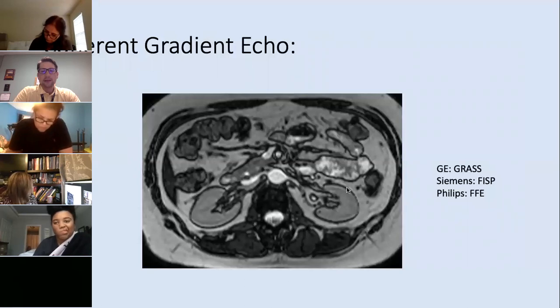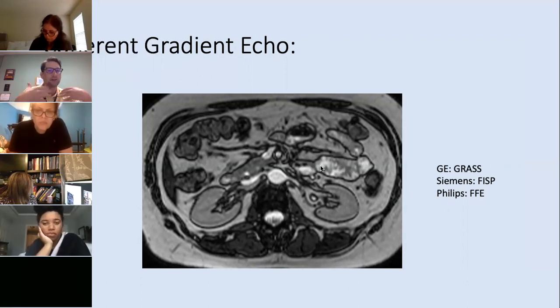So it's still not the best image quality, but it gets you what you need sometimes when you're trying to do abdomen imaging. So say they're looking at the kidneys or they're looking at the pancreas. They're able to see without the patient breathing and causing that motion artifact, because the motion is more detrimental than the bad image quality.